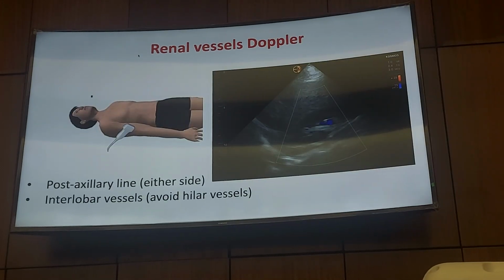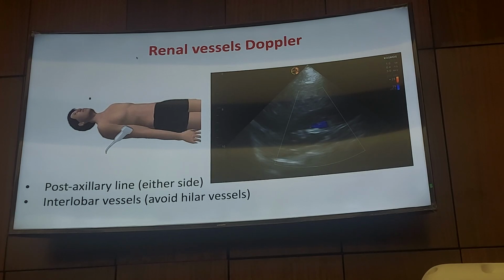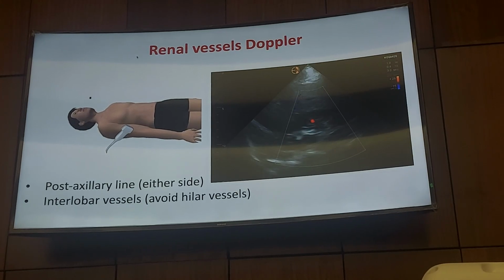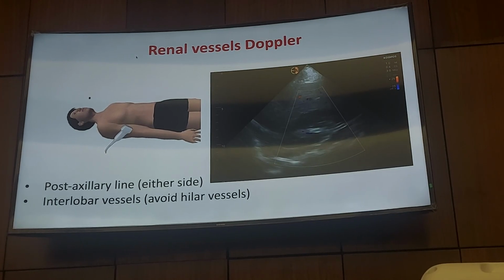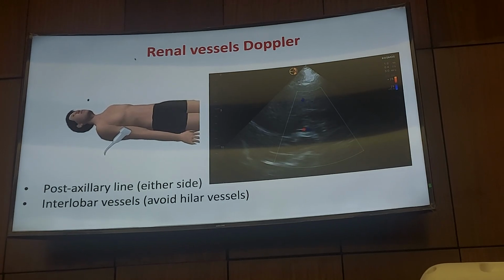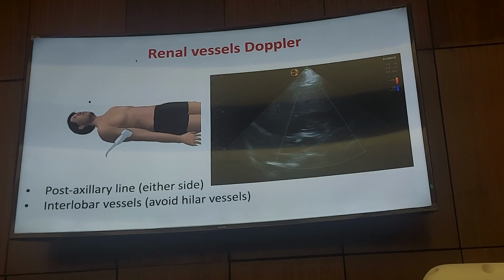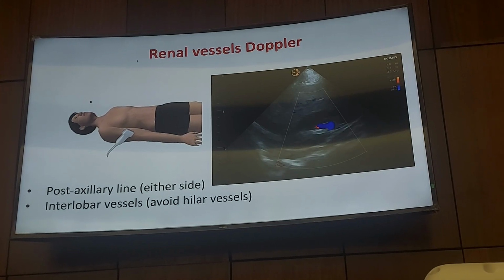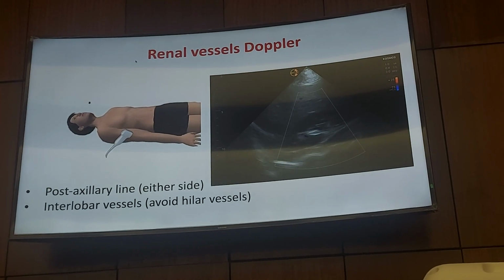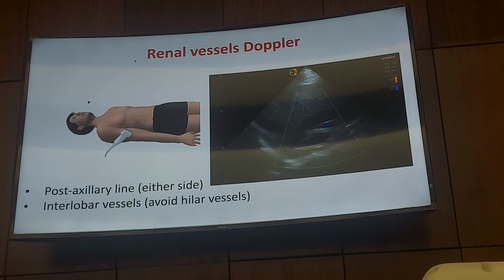Before I leave the portal vein, again, it was observed in 10% of healthy young volunteers that they might have portal vein pulsatility. And that is not fully understood. But that will be seen in the absence of all other signs of congestion. And I think it's a reminder to be humble about any parameter in ultrasound. We should never be blinded and follow one single parameter in isolation.